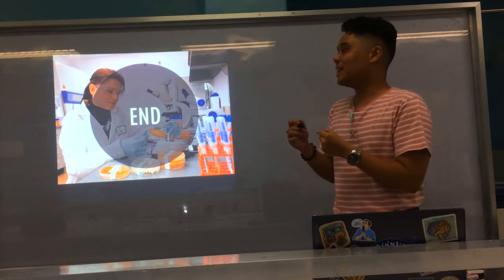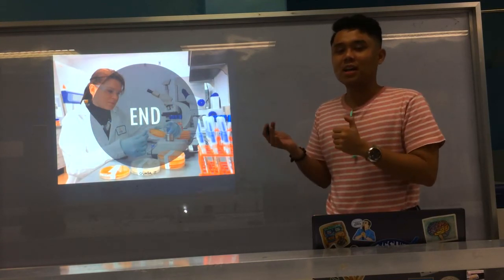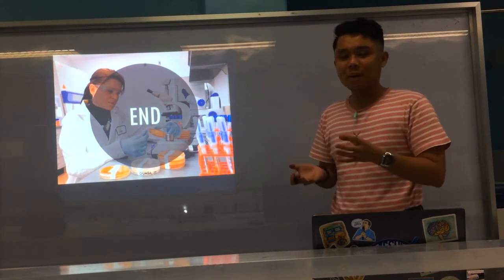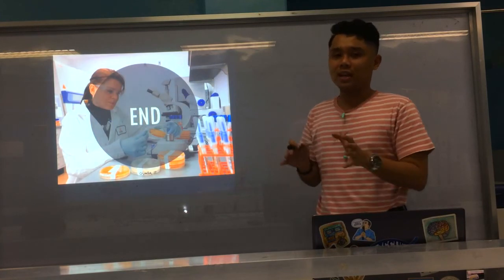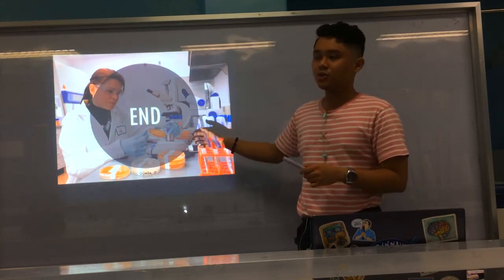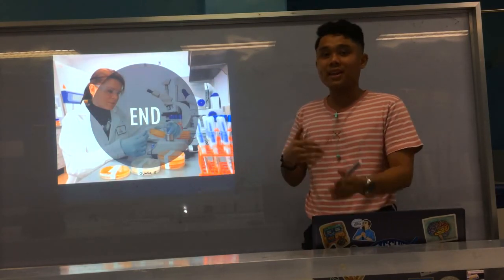Alright. And again, this is biochemical testing. We determine phenotypic characteristics. When you say phenotypic, physical characteristics like their ability to ferment sugars, the enzymes that they produce, and all those tests. And usually, in routine clinical laboratory, we use this biochemical testing. But again, biochemical testing has its own limitations.